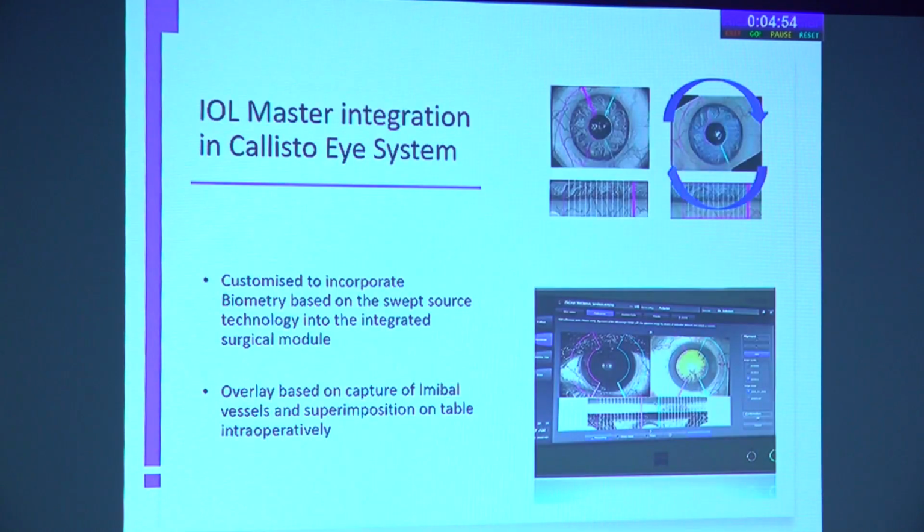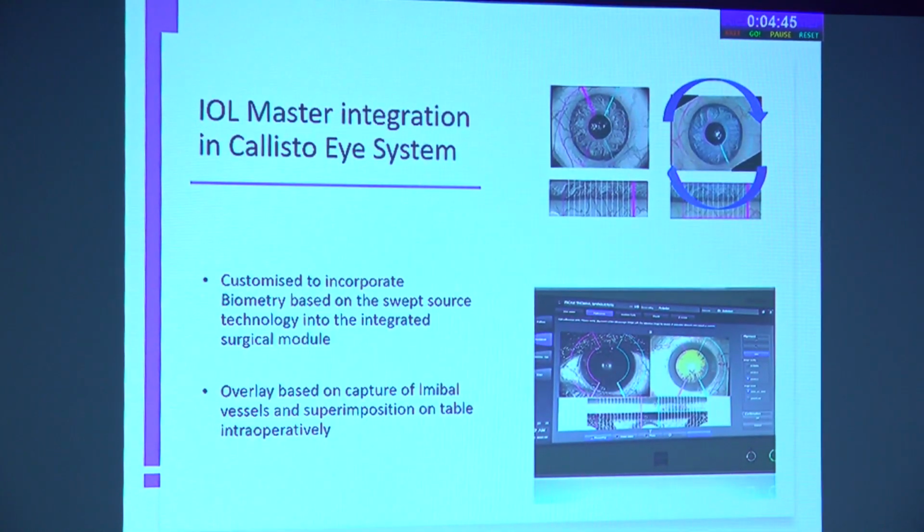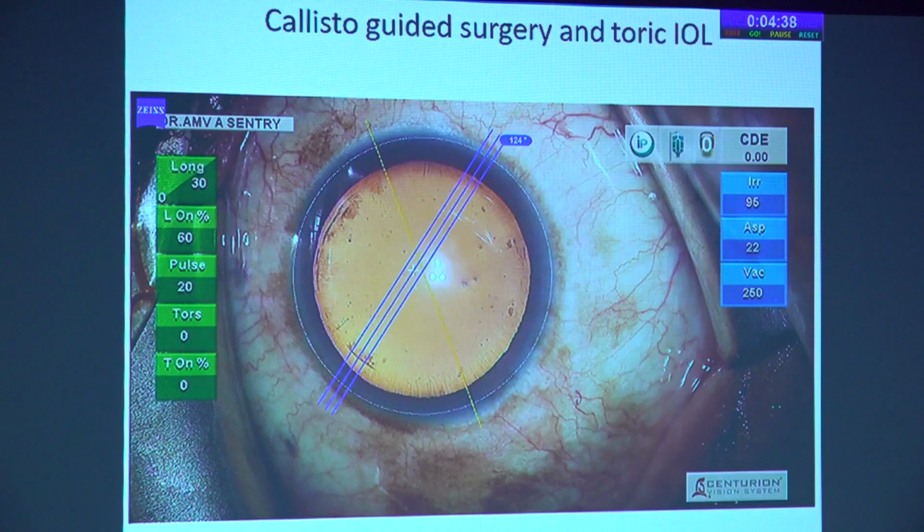toric IOLs. So you need the IOL Master to integrate with the Callisto system. It takes pictures of the patient's blood vessels and the limbus, and uses this as a reference mark to get the 180 degrees, and allows you to align your toric IOL along the respective axis. So this is a video of the same here.